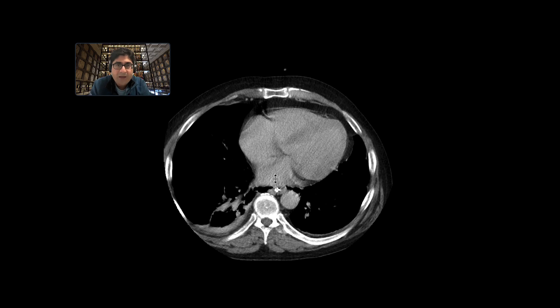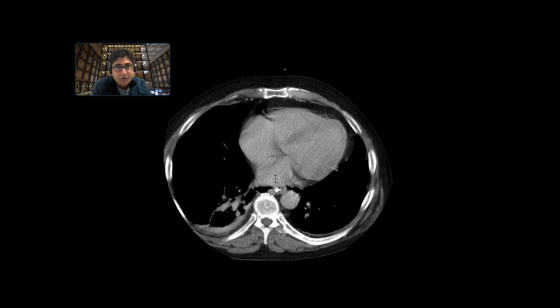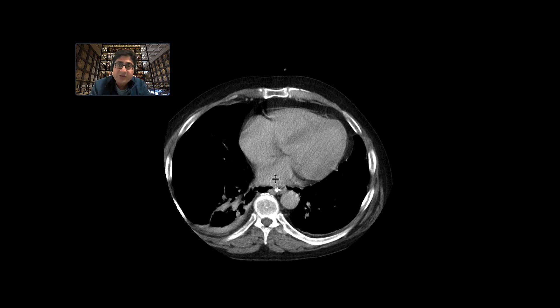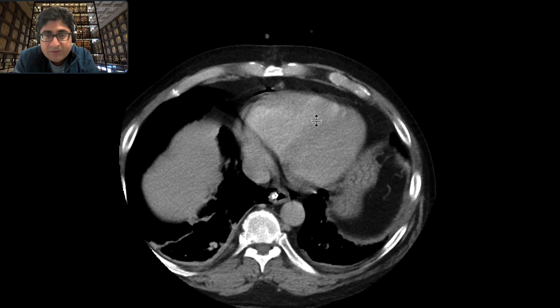This is a patient who had bowel surgery and had a few x-rays in the postoperative period that showed an increasing amount of pneumoperitoneum. They were worried about a bowel leak, so for this study they wanted to do rectal contrast in order to get oral contrast within the bowel. We did this with intravenous and rectal contrast.